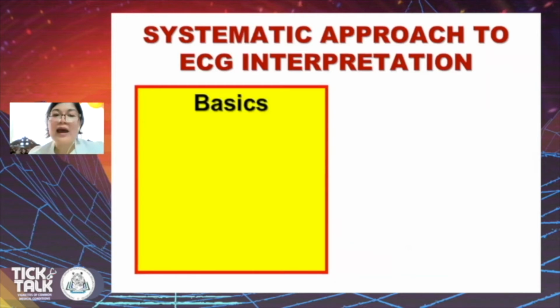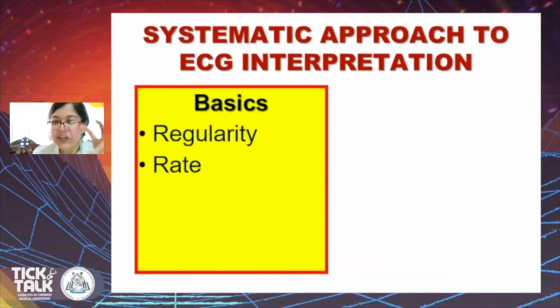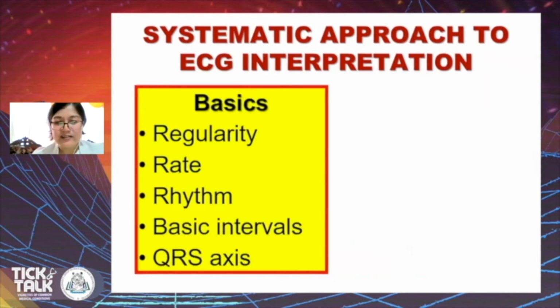So, normal ECG. For us to say that the ECG is normal, apart from being familiar with how the actual waveforms should look and what they represent, you will have to take a look at these criteria. Similar to beauty pageants, you have criteria for ECG interpretation. So let's go through this very quickly.